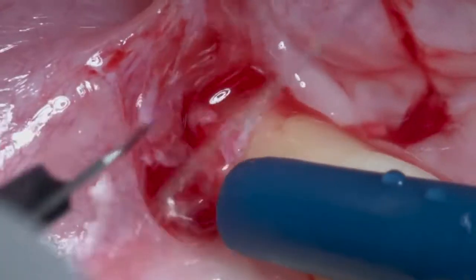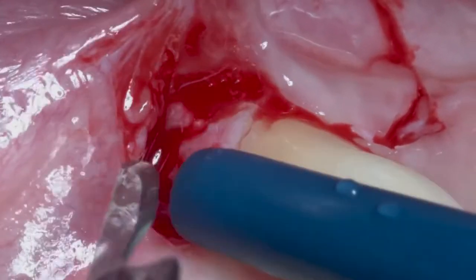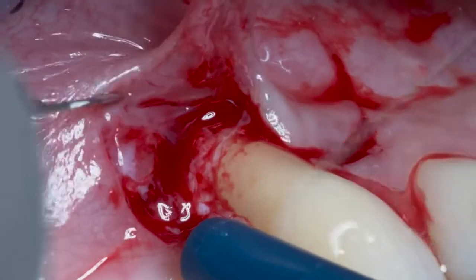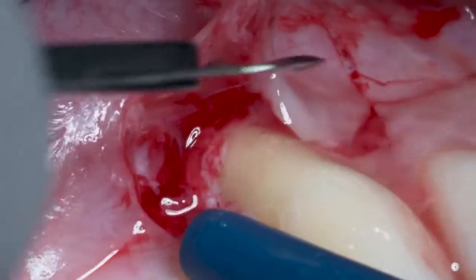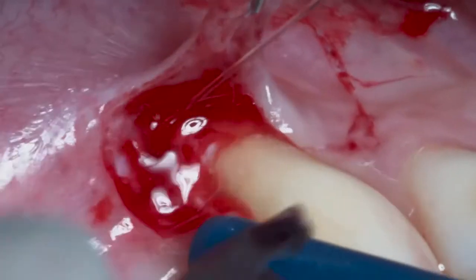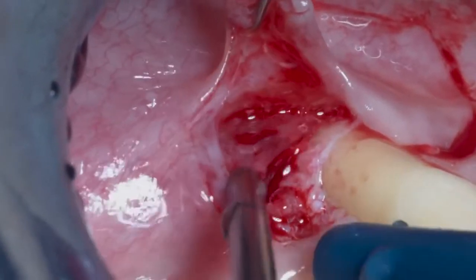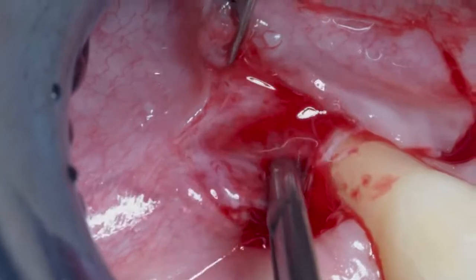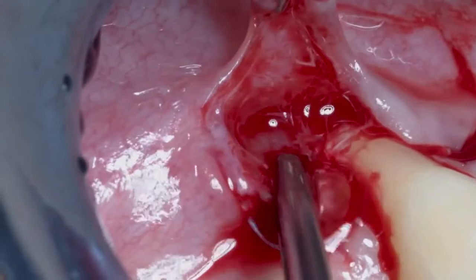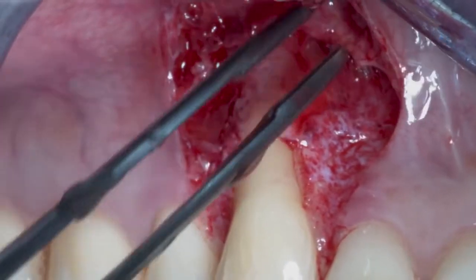The second concept is that you have to do your best to eliminate the muscular insertions — both the deep one and the superficial one. It's very difficult to start the muscular insertion incision because the first incisions are inside the muscles. As you can see in the video, the muscles become independent from the superficial mucosa once both insertions are eliminated.